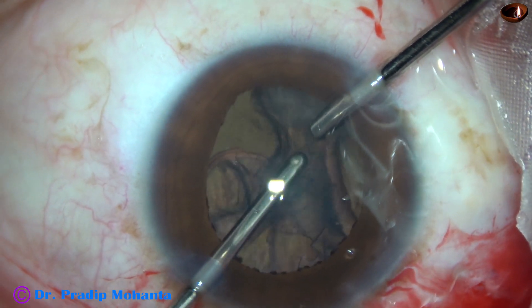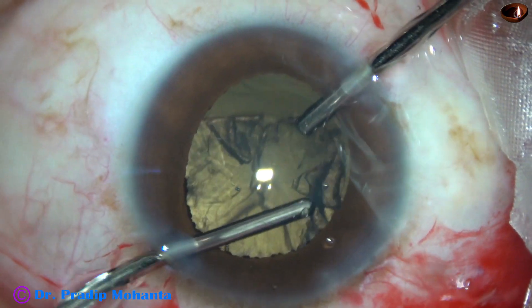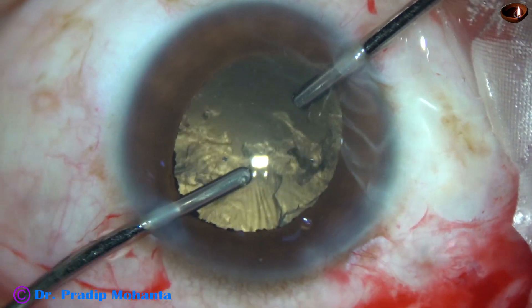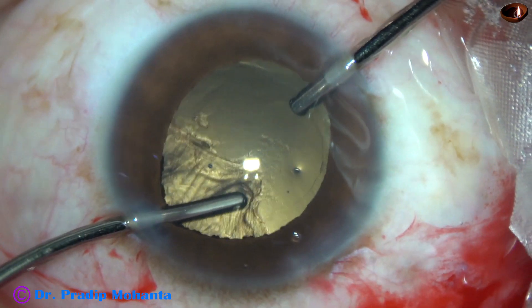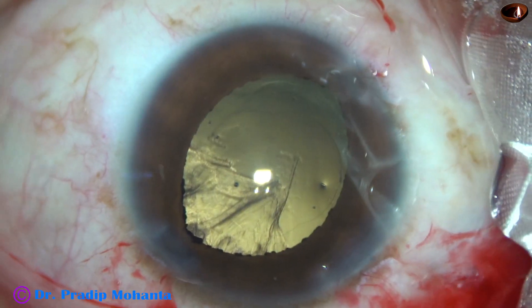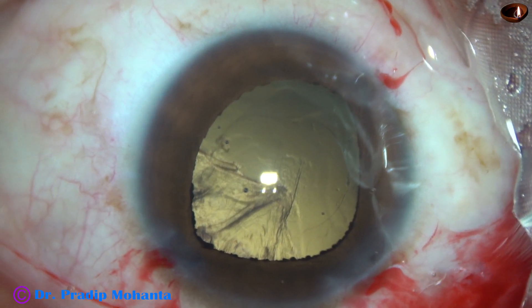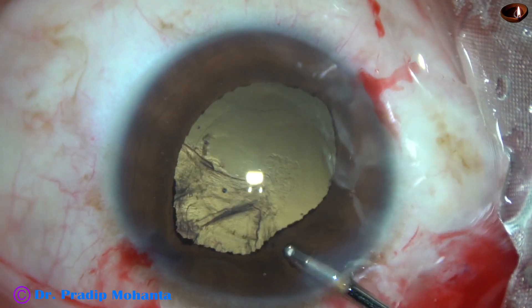After aspirating the cortex, I just closed the wound. My plan is to implant an intraocular lens once the retina settles and we can do a proper biometry. At that time, if the anterior capsular rim and the posterior capsule get fused and I cannot open up, I'll implant a multi-piece lens in the sulcus.